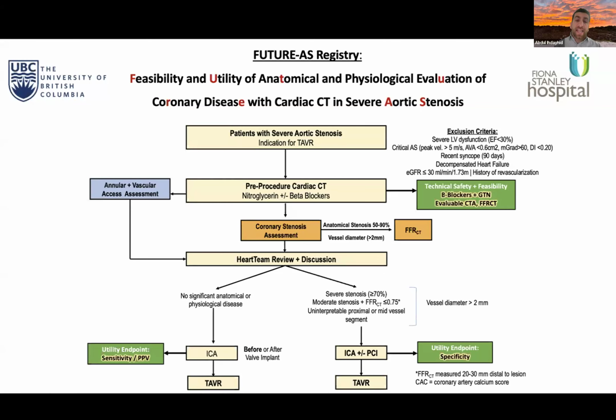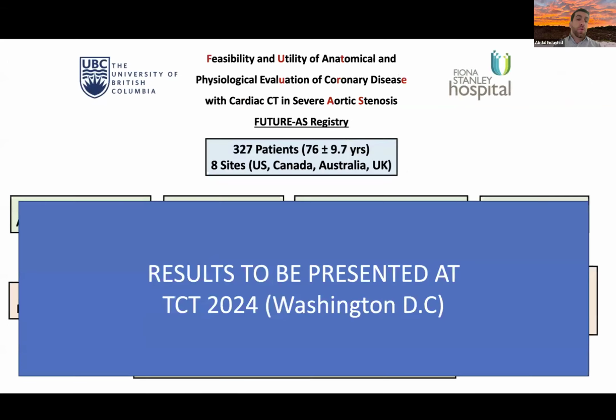And if they had moderate disease, we did an FFRct to better risk stratify. And that data became part of the heart team discussion. And we decided whether to defer invasive angiography or not, and therefore to guide decision-making. And we're planning to present these results at TCT.